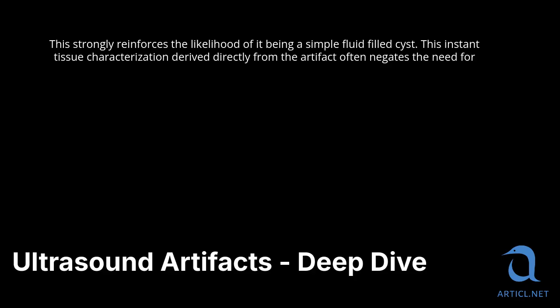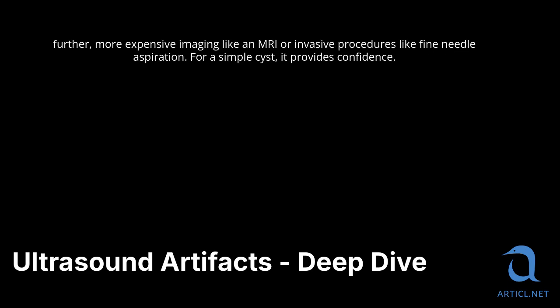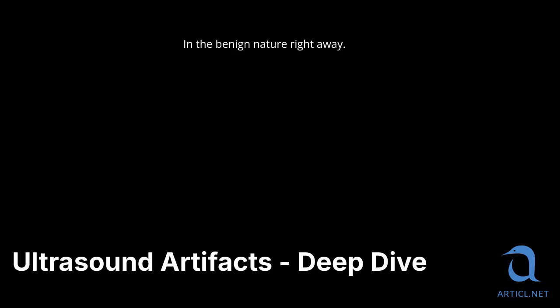This instant tissue characterization, derived directly from the artifact, often negates the need for further, more expensive imaging like an MRI, or invasive procedures like fine needle aspiration for a simple cyst. It provides confidence in the benign nature right away.